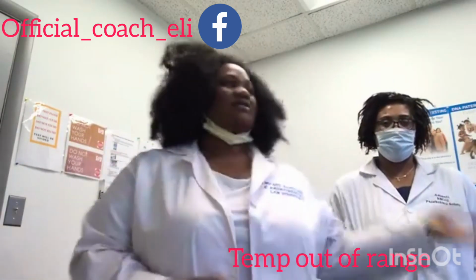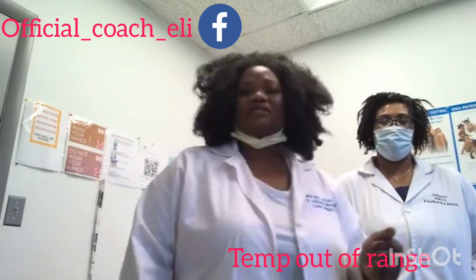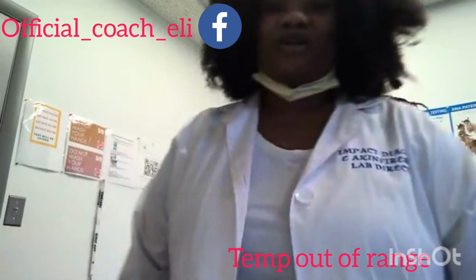With me here is Ashanti. She's my lab assistant, technician assistant, and she's going to be helping me today. She's going to be acting as the donor, and I am going to be the collector. So we are going to get started.